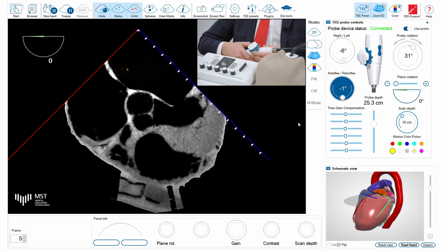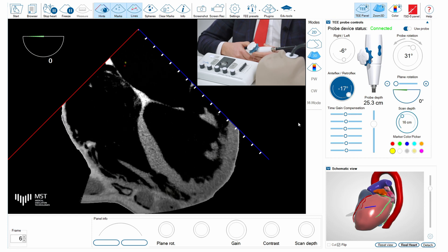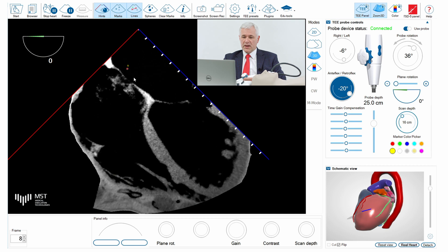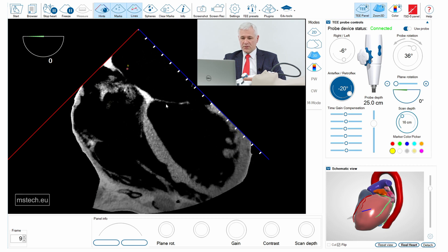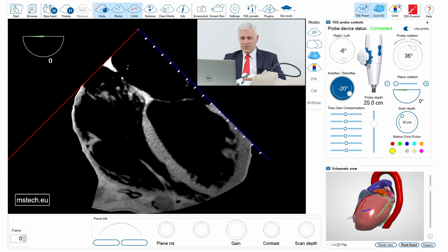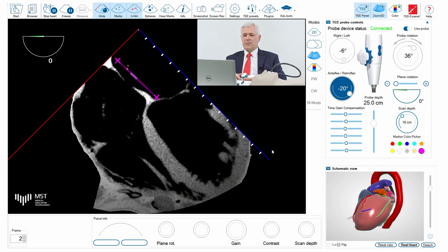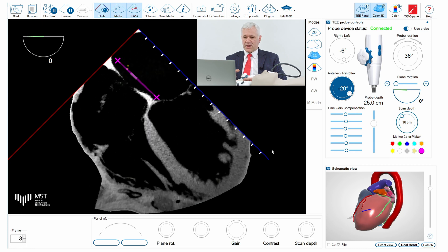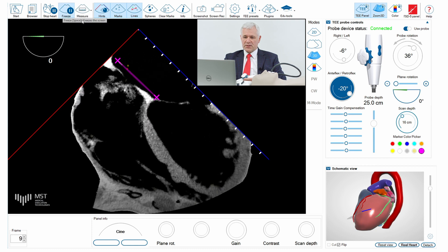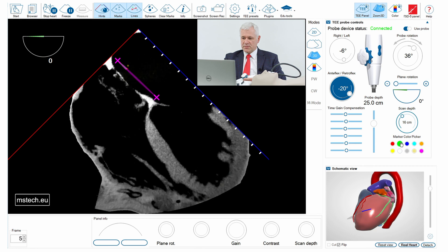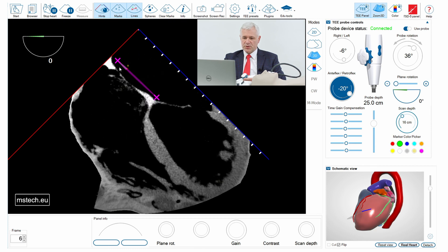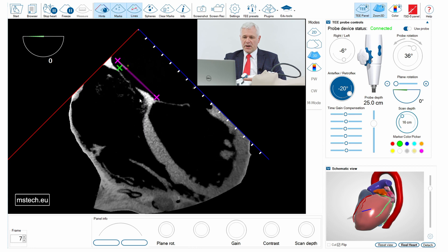Then I go to zero degrees and try to obtain the mitral view image, retroflexing the probe to obtain the longest possible distance from the mitral annulus to the free wall of the left atrium. Then I select the third plane, which shows the so-called height of the puncture above the mitral valve. For a mitral clip procedure, for example, we have to puncture the septum approximately four centimeters from the annulus, so I measure that distance now. The best possible puncture site for this given patient should be approximately here, and I mark it with the green marker.